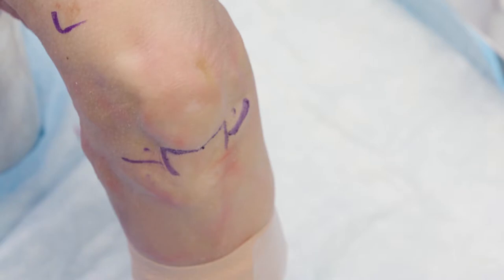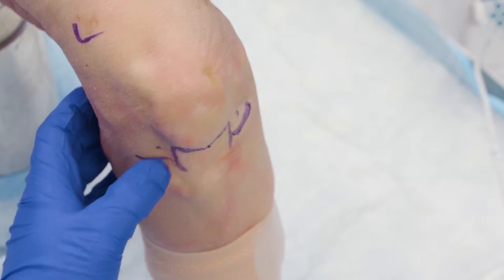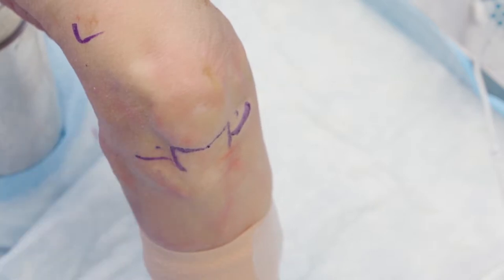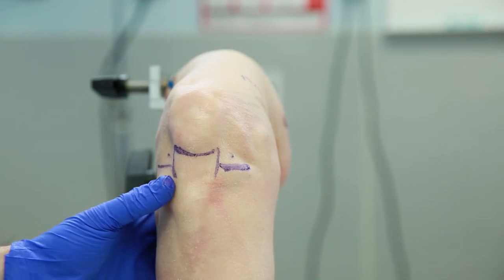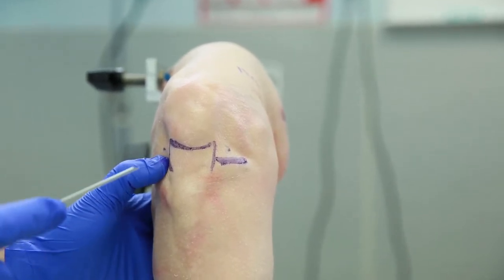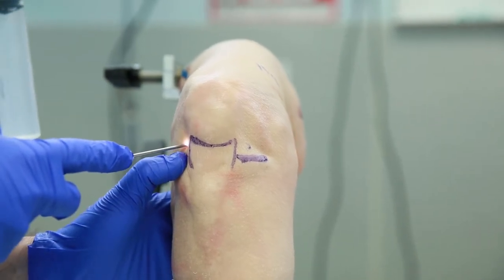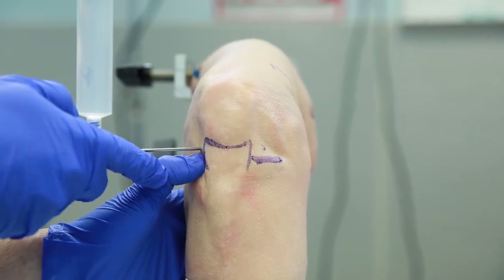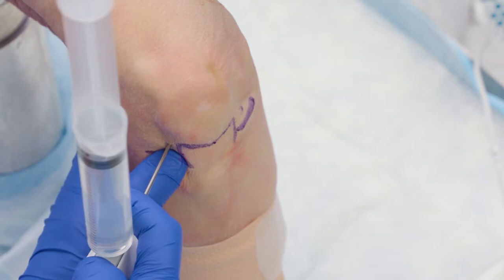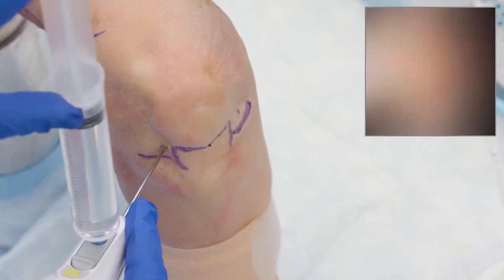We've already anesthetized our patient. I'll start by entering from the lateral portal. Just like in surgery, it's good to have a routine so you don't miss anything. This is a 14-gauge needle — I'll hold it with a little finger choke up on it, and aim right for the intercondylar notch as I push in. Aiming for the notch is reproducible and helps prevent iatrogenic cartilage injuries. Once I'm in, I'll retract, which gets me around most of that fat pad and brings me right to the ACL.